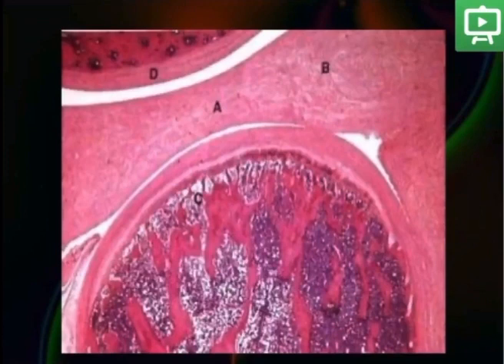Here is a sagittal section of the TMJ of a child, and we will know why. Now, A are the collagen fibers at the central portion of the articular disc, which run more regularly aligned in anterior-posterior direction than at the periphery, which is part B. In B, the collagen fibers are irregular, running with a transverse as well as superior-inferior direction, giving a more convoluted appearance at the peripheries.